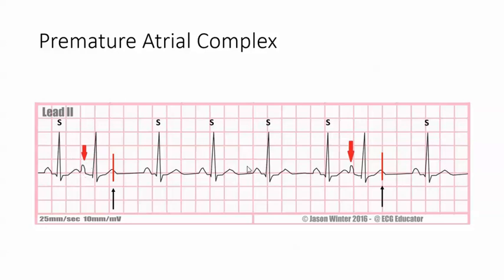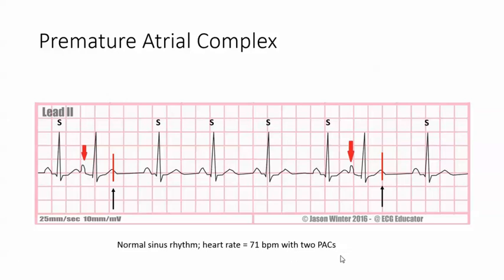If you measure the distance between this R wave and this R wave, there are 21 small squares. 21 goes into 1,500, so the rate is 71 beats per minute. The way you would report this is: normal sinus rhythm with a heart rate of 71 beats per minute with two PACs.